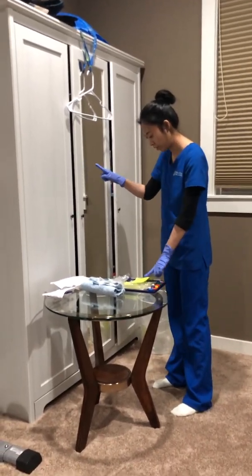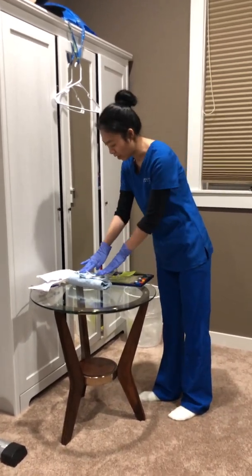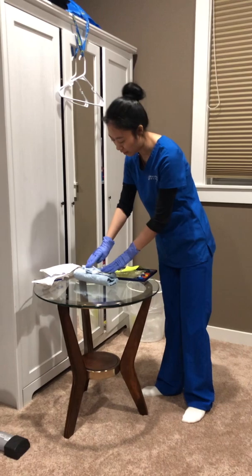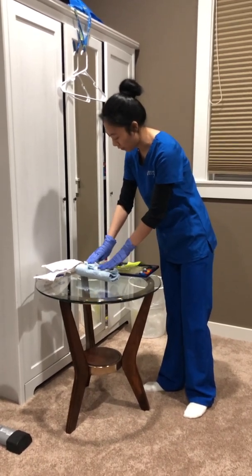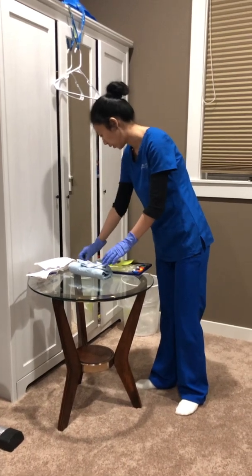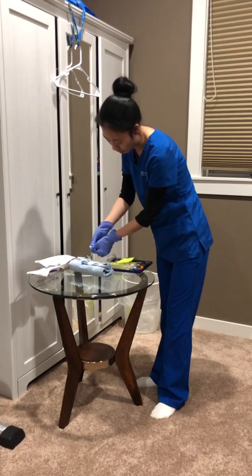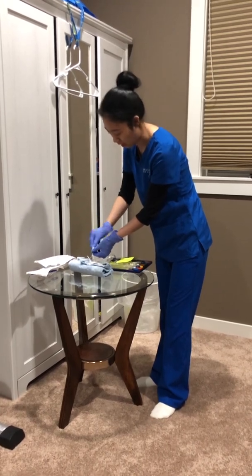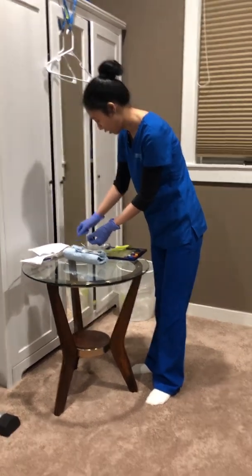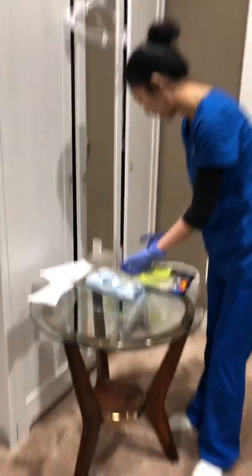The medications are right. Now I'm going to check your skin to see if there's any phlebitis, no warmth, no infiltration, the IV site looks good. Then I'm going to use the alcohol wipe to wipe your port around 30 seconds and let it dry. I'm going ahead to give you some normal saline to flush it, okay?